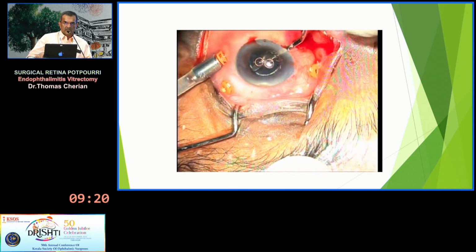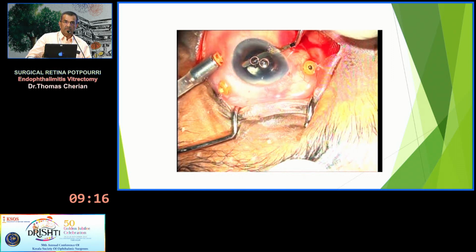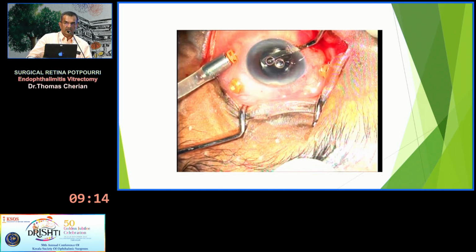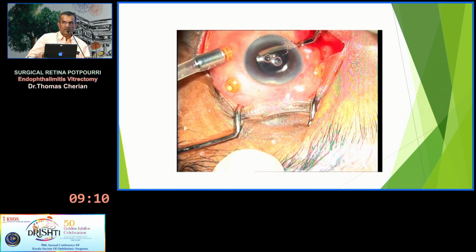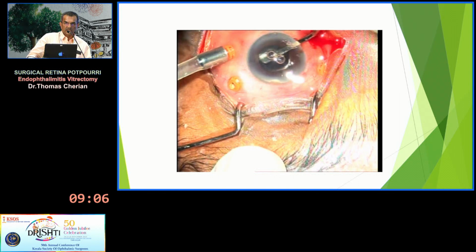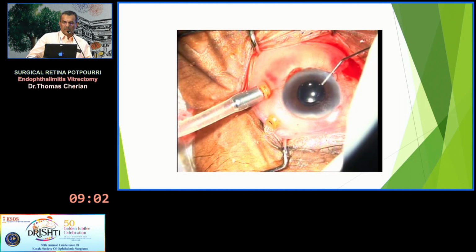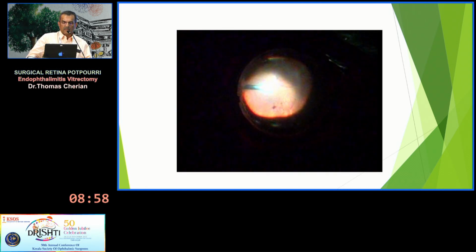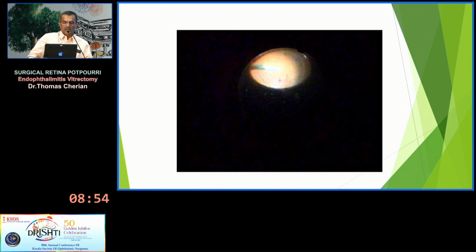All these procedures are possible and should be attempted during an endophthalmitis vitrectomy, because left behind this could gradually cause the IOL to slightly subluxate into the AC. So that is relieving the synechiae, again completing the vitrectomy and then pulling out.